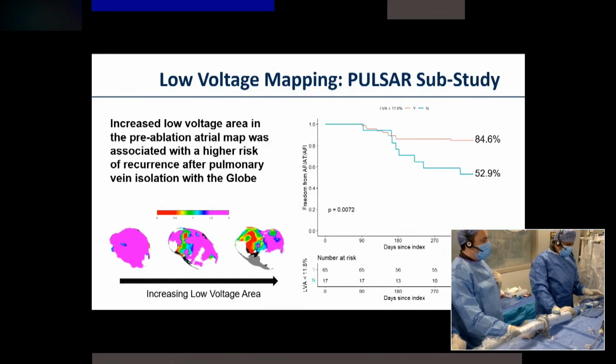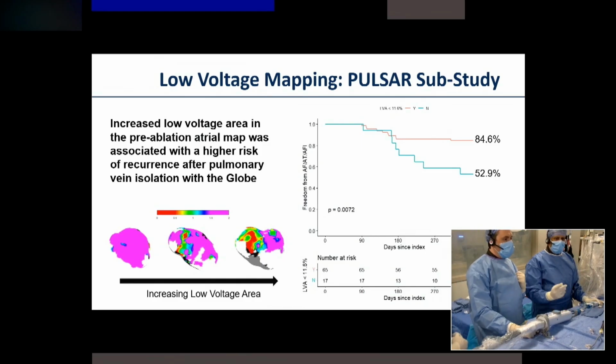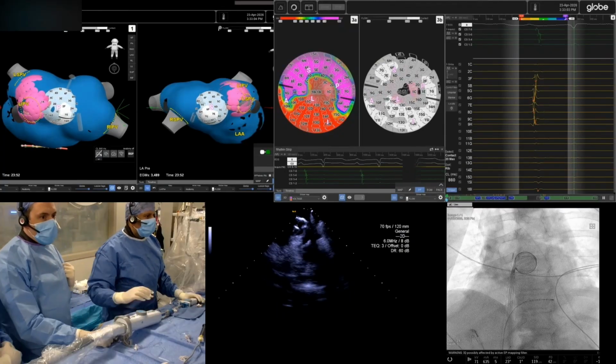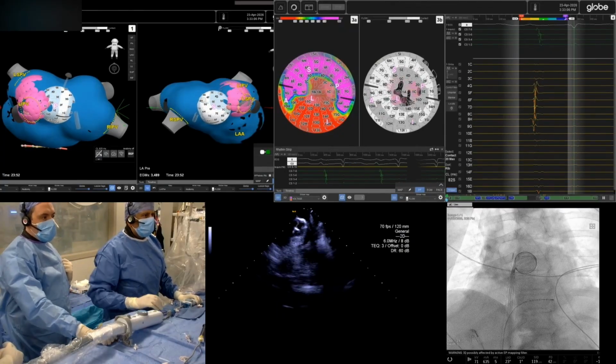Anyway, Srini, do you want to go ahead and show us what you're doing here? Yeah, so this is just the 1-year results there. I don't know if you want to mention that, or I can just show you what we're doing so far.